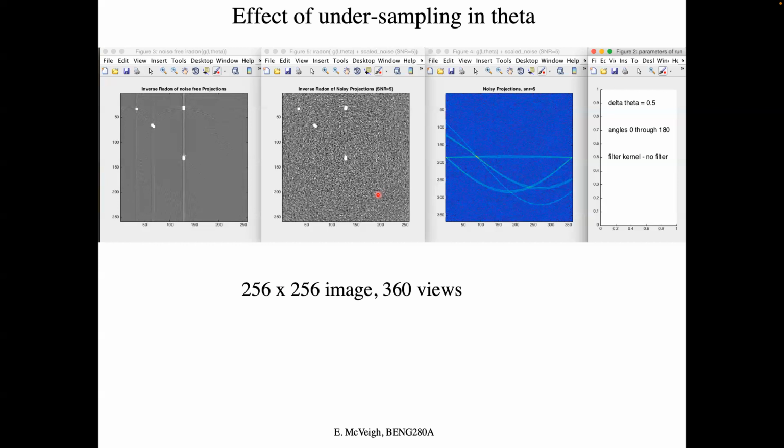A signal is generated by a photon hitting the detector, making a flash, right? So if I take 100,000 views, how many flashes do I get per view? Not that many, right? So eventually I just run out of photons. I have a finite number. And this is usually done with the current adjustment in the X-ray tube. So you make your X-ray fluence and the rotation of the gantry such that you get a reasonable number of photons in each view, right? So that's one limiting factor.